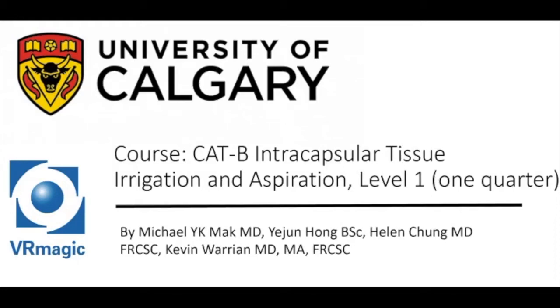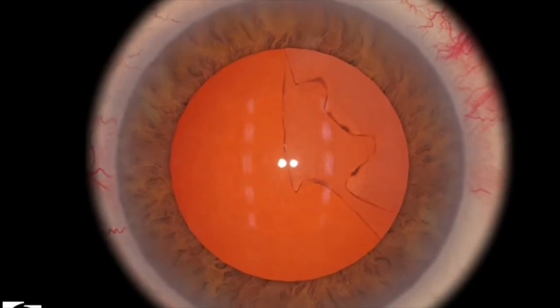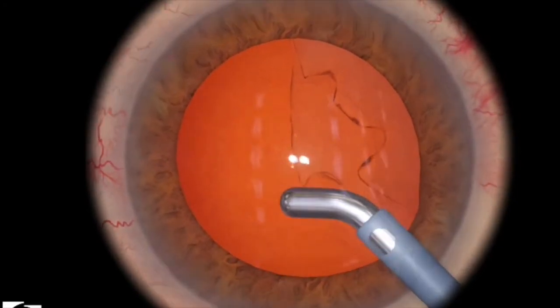Hello, my name is Dr. Michael Mack. I'm here to cover the level of Cataract B, Intracapsular Tissue Irrigation and Aspiration, Level 1, 1 quarter. This level is basically teaching you how to manipulate and use the Irrigation Aspiration probe.